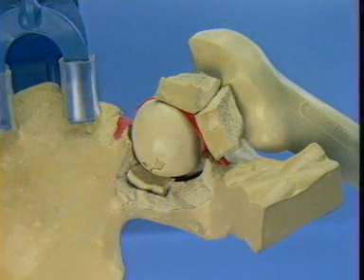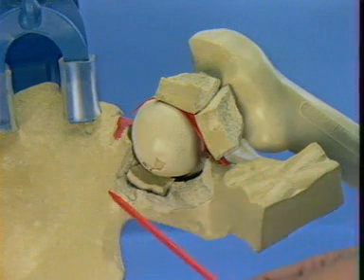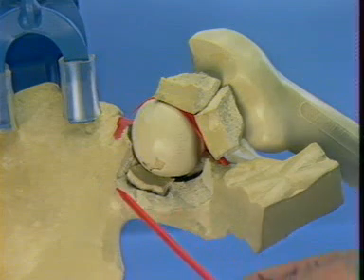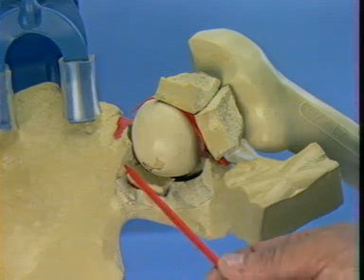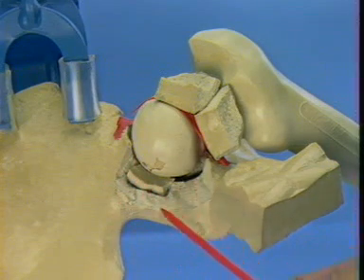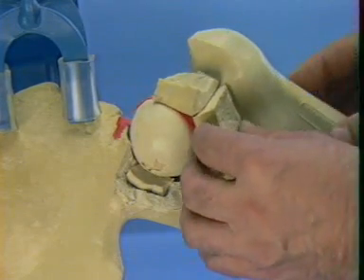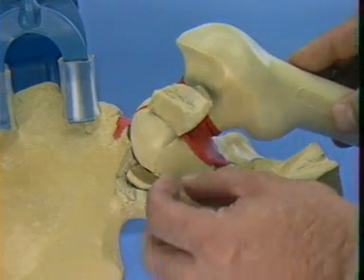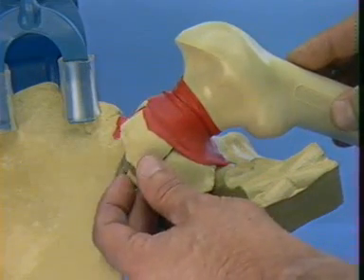The bone is placed in a vise as if the patient were in the lateral position and the surgeon standing behind the patient. After performing a Kocher Langenbeck approach, the surgeon has a view of the posterior column of the acetabulum and the retroacetabular surface, which is seen to have a defect where the fracture of the posterior wall is. Two fragments of the posterior wall, which include a portion of the retroacetabular surface, are seen attached to the hip capsule.